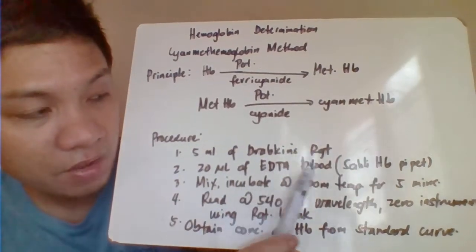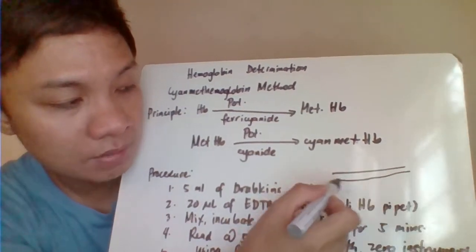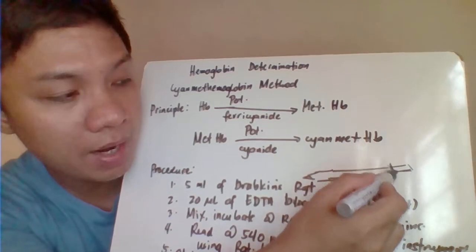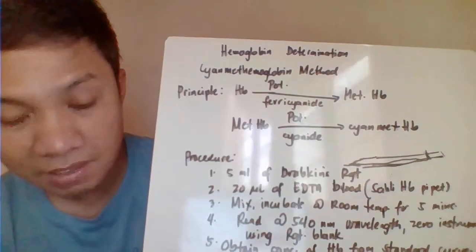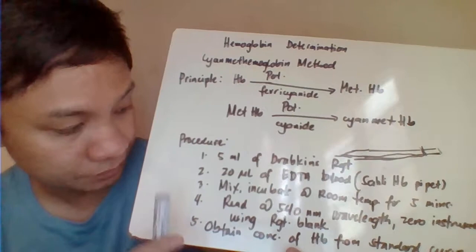You can use your Sahli hemoglobin pipette. The Sahli hemoglobin pipette is similar to our RBC pipette, only it doesn't have a bulb. It has a mark here. You aspirate your blood up to this mark, and that gives you 20 microliter. But you can also use your micropipette for that.